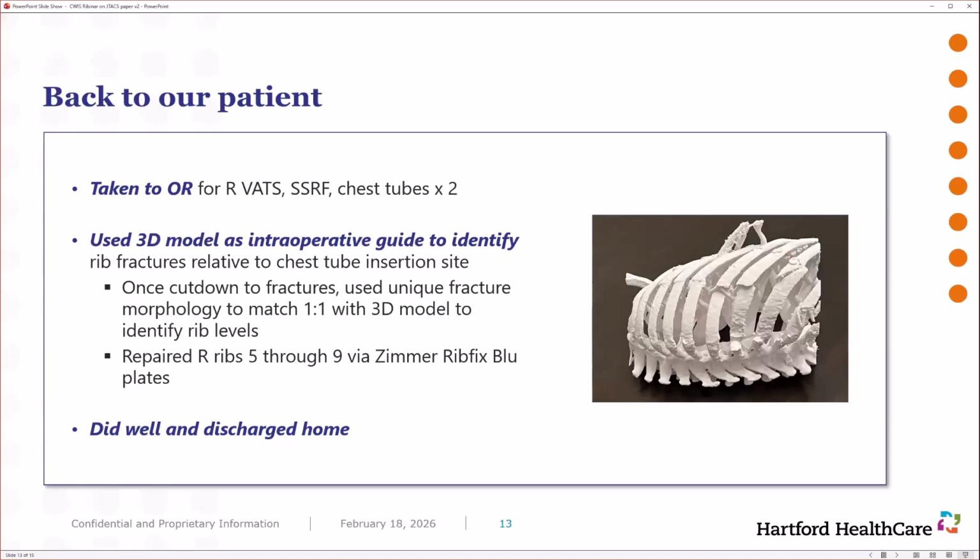Yeah, that's an idea that a lot of people have proposed, to prepare plates and things that are customized for the patient, but you have to remodel it in the reduced form, right? Because you wouldn't plate the fractures as they stand. So here's the fracture pattern. What does it look like when we reduce the fractures, and then how do we prepare plates for that? I think that's going to be the interesting challenge in the future.